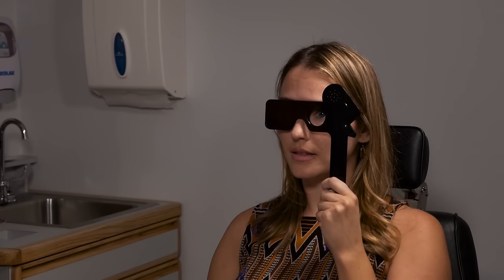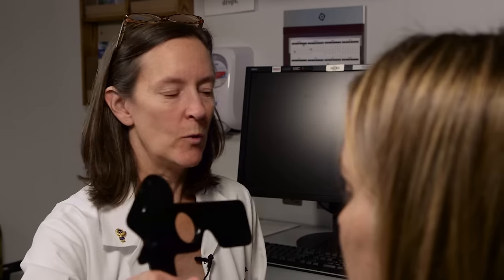You can actually switch to reading numbers, which some people with aphasia can read but not letters. If people are having trouble with reading, you can move to a single letter. People with amblyopia or small areas of field of vision or scotomata can see single letters and numbers better. Nine. Six. Nine. Five. Fantastic. 20/15. Great.